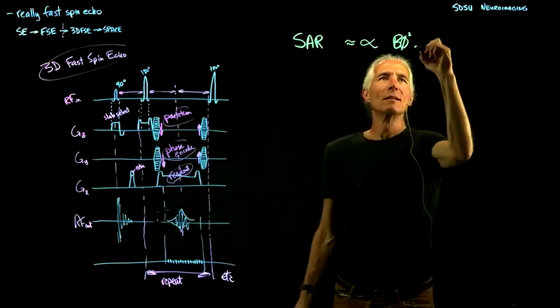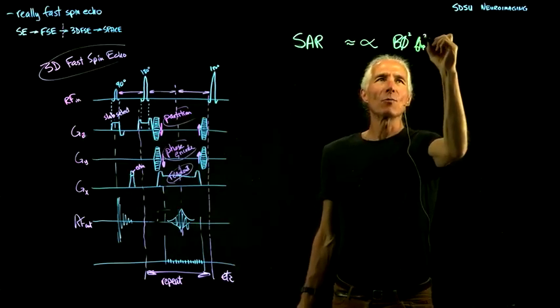It's also dependent on the flip angle squared.